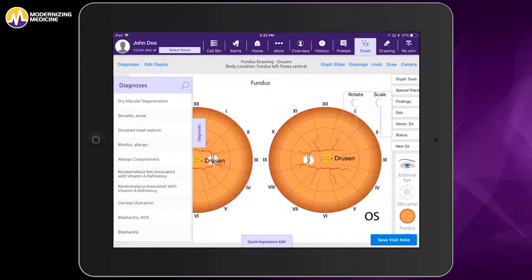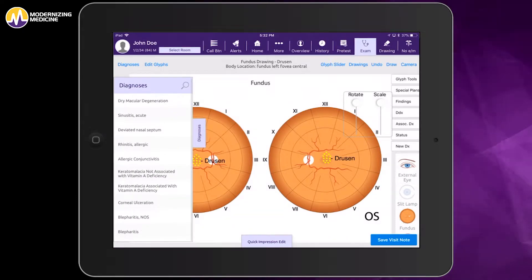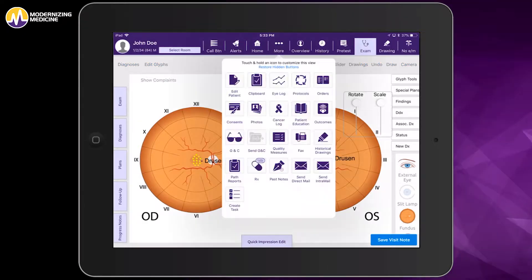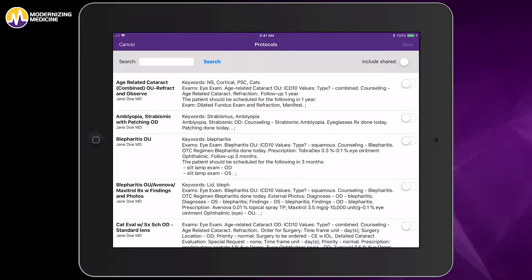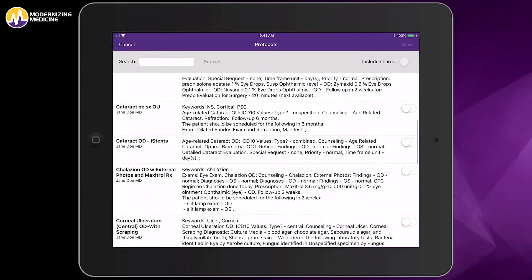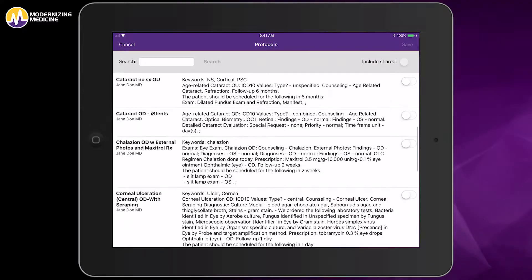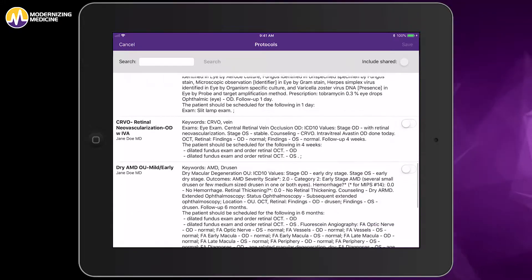Next, I can select a diagnosis from the left-hand column based on what I do most often. However, for this demonstration, I'm going to do something a little quicker and go to my protocols. These protocols are preemptively built-in diagnoses and plans of action based on what I do most frequently, like a macro.